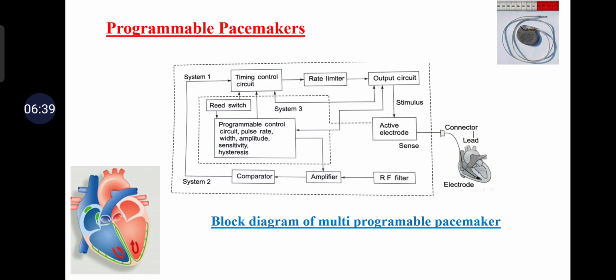The programming information is contained in a 20-bit command code specifying the desired rate, pulse width, pulse amplitude, sensitivity level, mode of operation, pulse generator model identification code, and check codes. If an attempt is made, intentionally or unintentionally, to include in the programming command a parameter that is not a feature of the pulse generator being used, that parameter will simply remain at its nominal value. All validly programmed parameters in the command will be implemented. Part of the command code is a check code. If this check code is not correct, the command is rejected by the pulse generator.